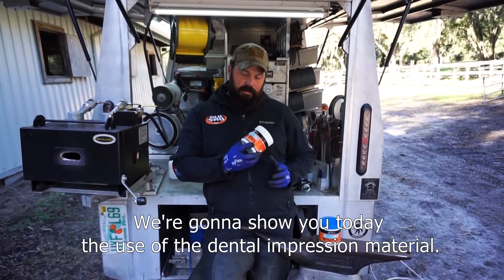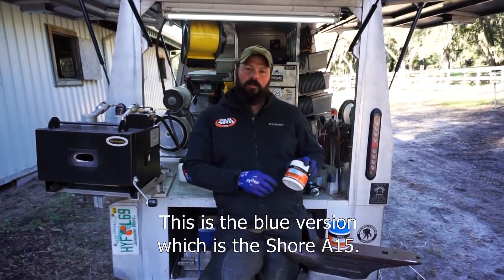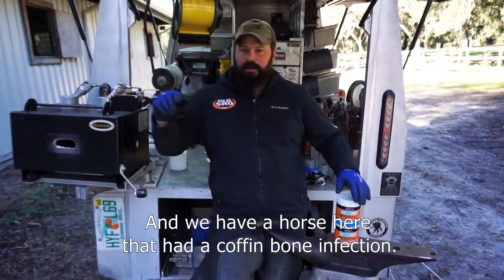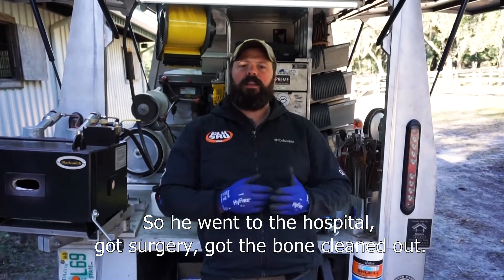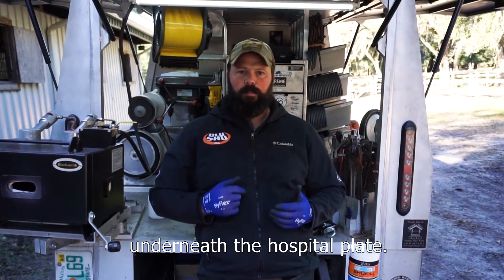We're going to show you today the use of the dental impression material. This is the blue version, which is the Shore A15. We have a horse here that had a coffin bone infection, so he went to the hospital, got surgery, and got the bone cleaned out.